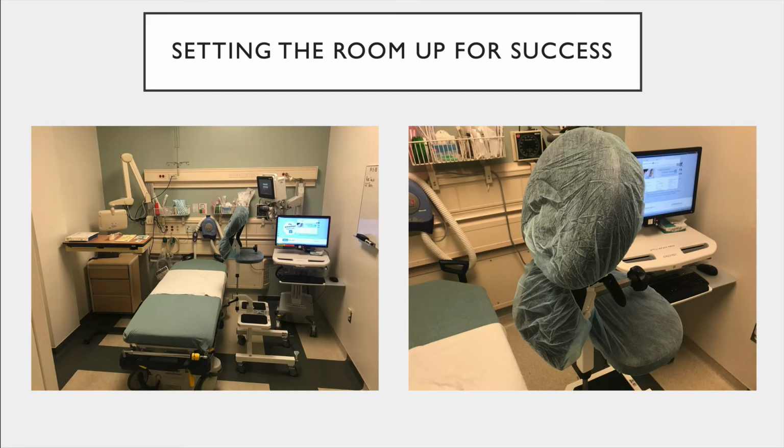The ideal scenario in the morning time is to have your room set up just like the picture on the left-hand side. You want to be ready to roll, so your attending just has to walk into the room, put sterile gloves on, watch you place the epidural kit, and then move on over to the next one. Sometimes there's 5, 6, 7 epidural catheters in place. So you can maximize your efficiency by setting the room up just like this.